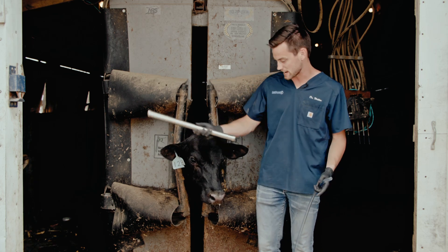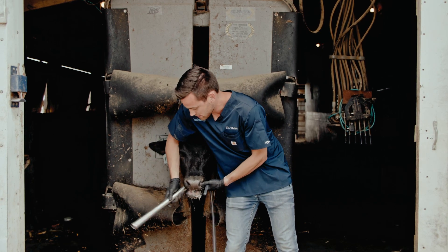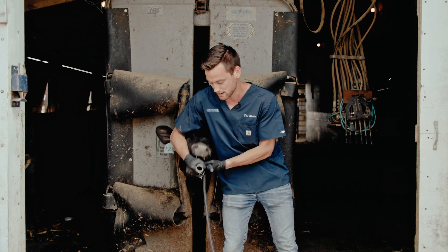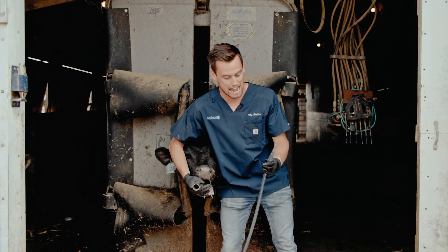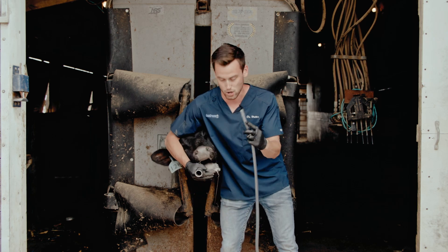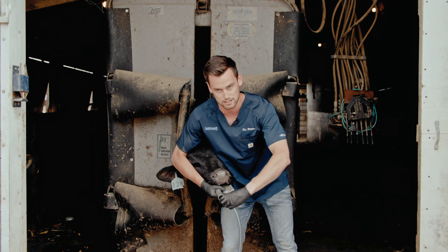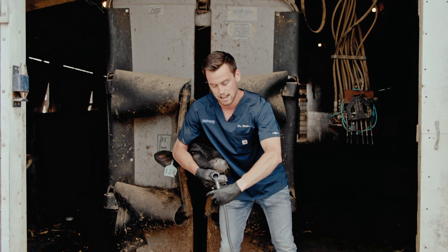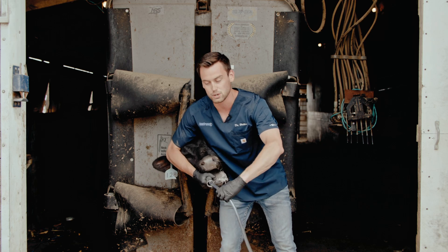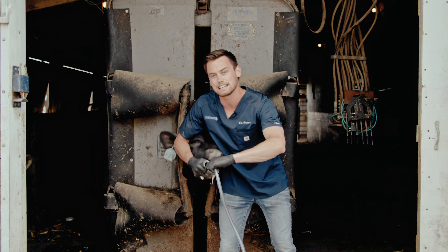Take the metal speculum in one hand, open the mouth a little, and enter it in about halfway just to get past the molar so they can't chew on the tubing. Then, using the curved end of the hose with multiple holes, start feeding it through nice and gentle — feed the tube in over halfway and you'll be able to smell the rumen, confirming you're in the right stomach and not the trachea.